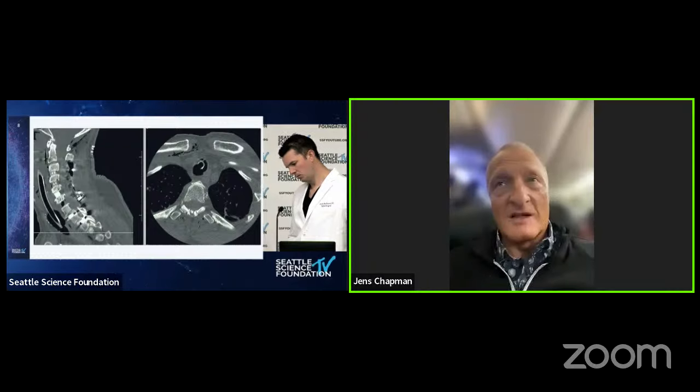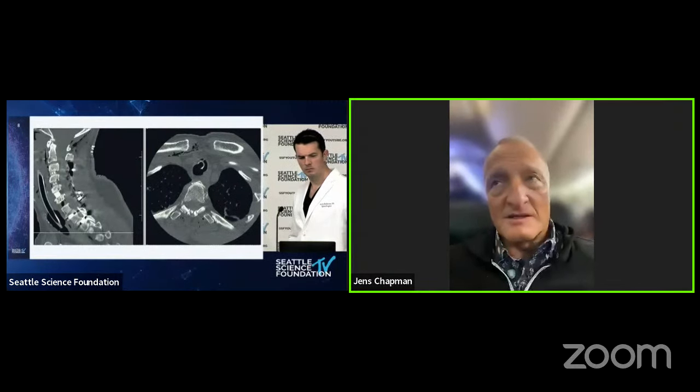For posterior surgery, I try to do wide foraminotomies preemptively nowadays because one of our fellows did a great study on the subject and showed that this is most likely a traction phenomenon. And this would also fit to the proning of the patient. And we do use temporary shoulder pull down, but we release that the second that we have the hardware placed. So we did that in her case also.